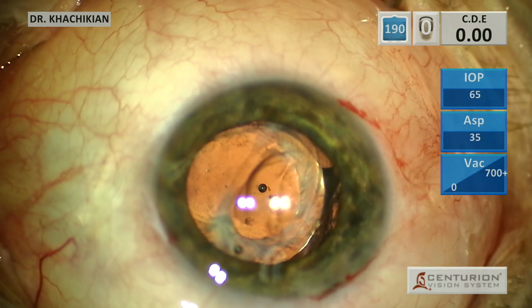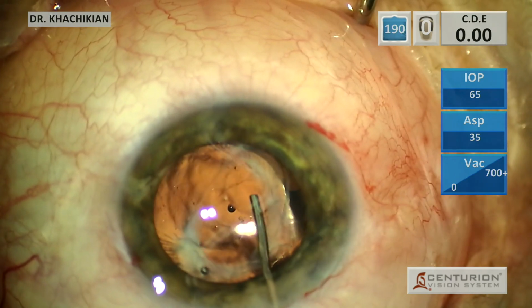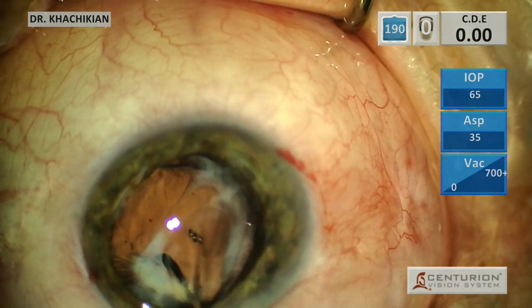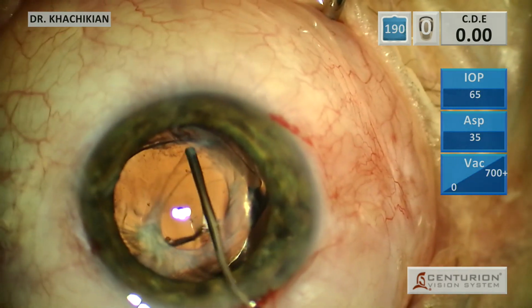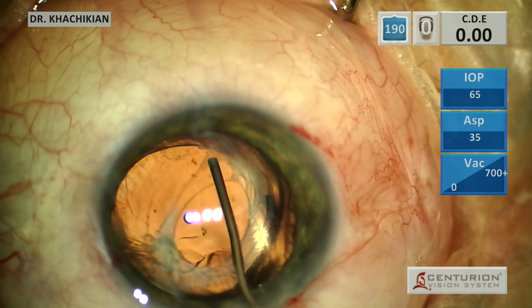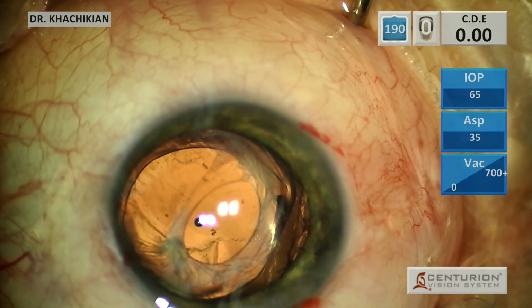So we'll use maybe a Sinskey hook and try and free up the haptic and get that lens to rotate. Ideally, you can see that the haptic superiorly in the view there is still kind of bent on itself, so that may or may not be totally open. Oh, there we got some opening going. There we go. That was it. That capsule had fused together, I think, in that spot.